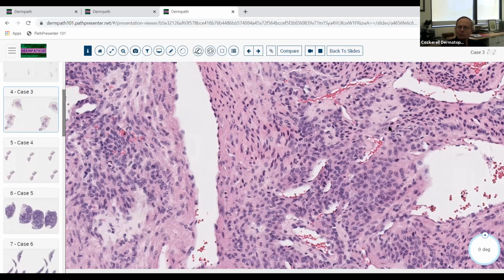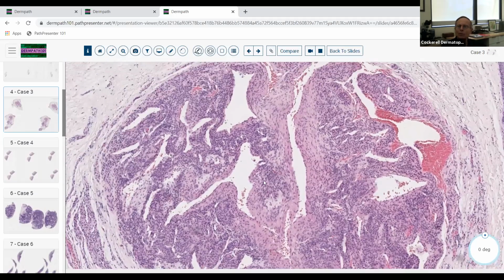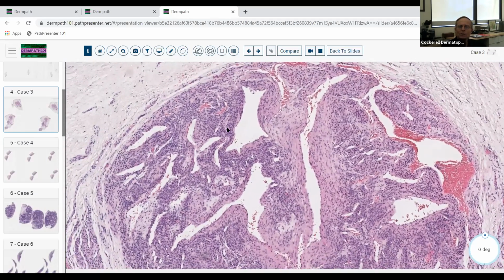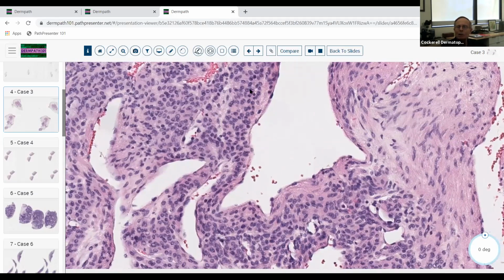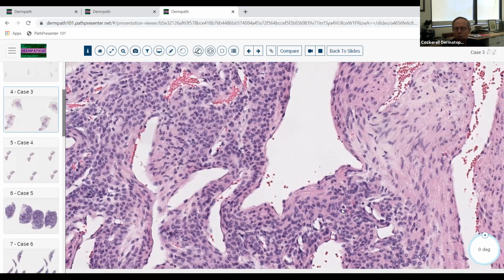The next thing is to say, well, does it look like a typical cherry hemangioma, for example? Well, no, it really doesn't. It's got all these additional cells in it that are round. They're very homogeneous, look pretty much one like the other. So you might be thinking of a cellular vascular lesion. It's in the family of the hemangiomas, but because these cells look very round and very much like one another, that's very classic for when we think of glomus lesions, glomus tumors.